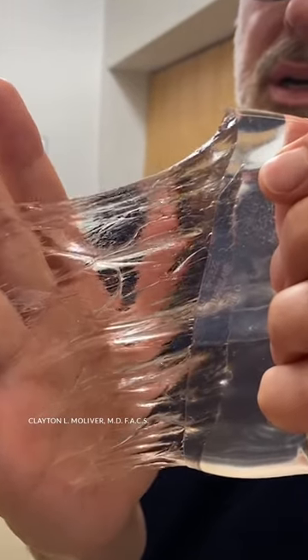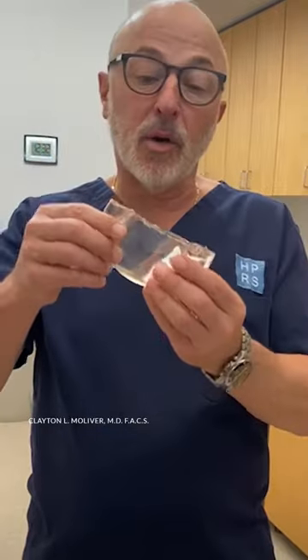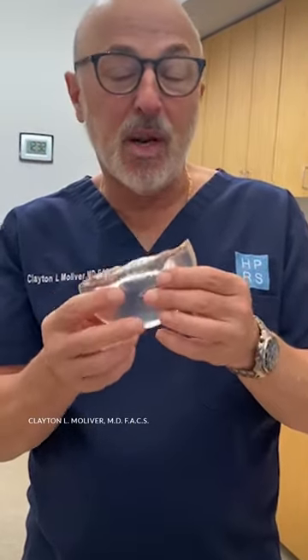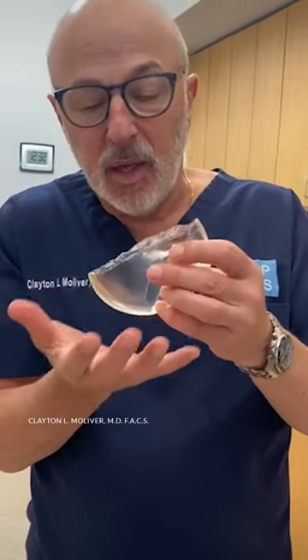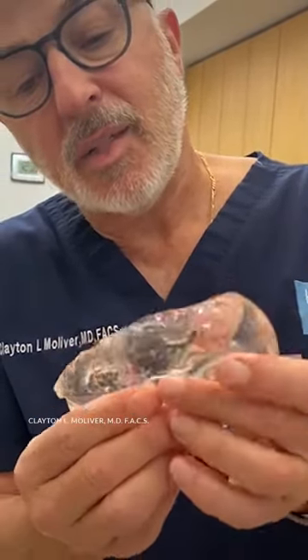Come closer. Here's an implant — a fifth generation gummy bear cohesive gel implant that I cut in half three weeks ago and put in my blanket warmer in a container. You can see what it looks like, and it's pretty much intact, right?